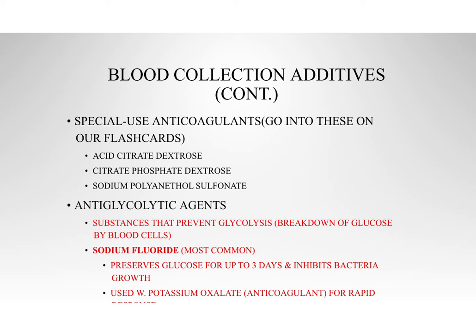The most common additive that does this is sodium fluoride. This will preserve the glucose for up to 3 days and prevent bacterial growth. This is also used in conjunction with potassium oxalate.